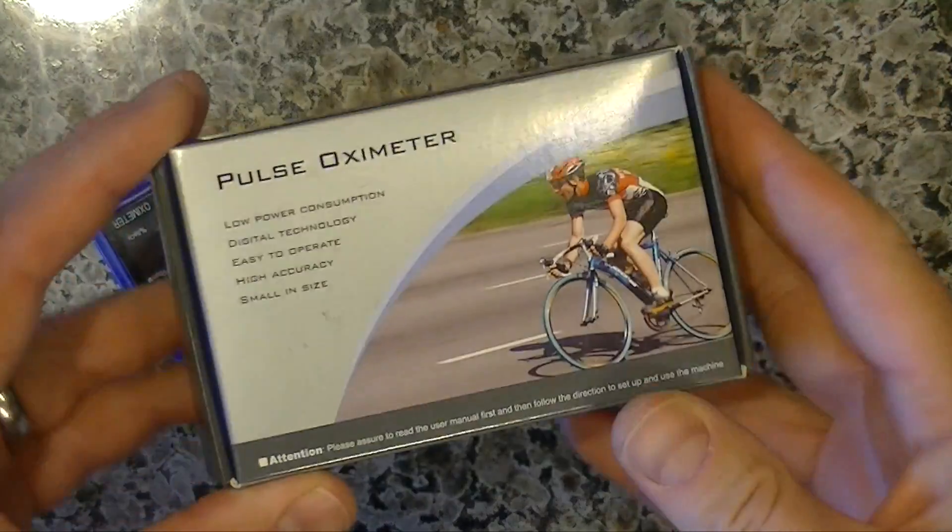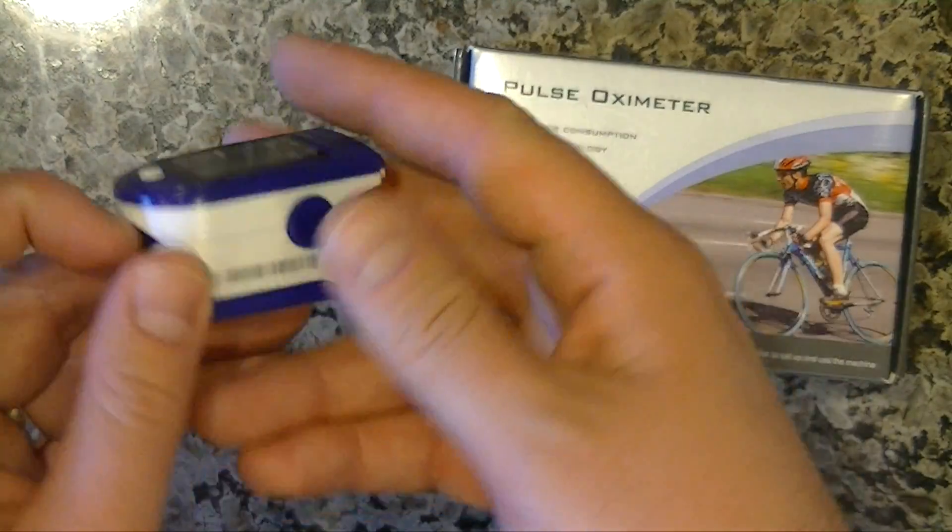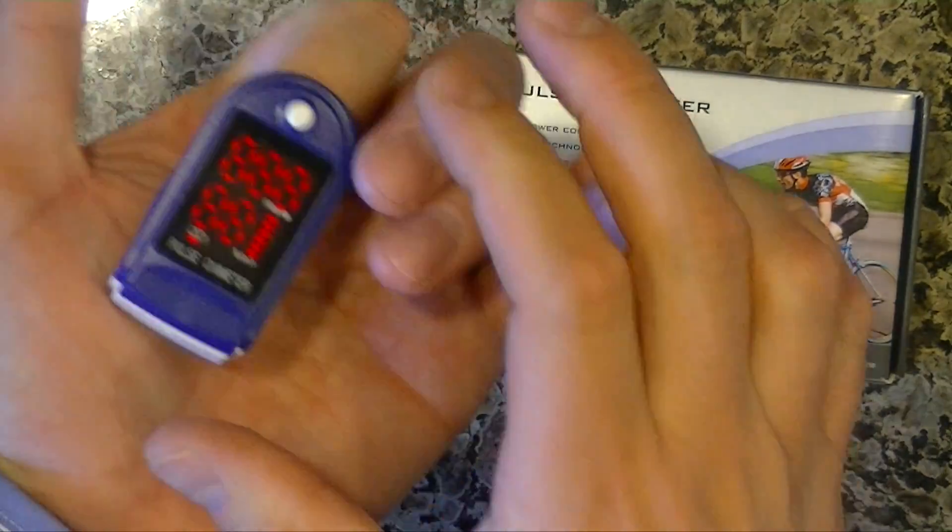Hi, it's Andrew. In this video, I want to tell you about the Pulse Oximeter. This is an oxygen sensor. I'll go ahead and put it on and push the button.